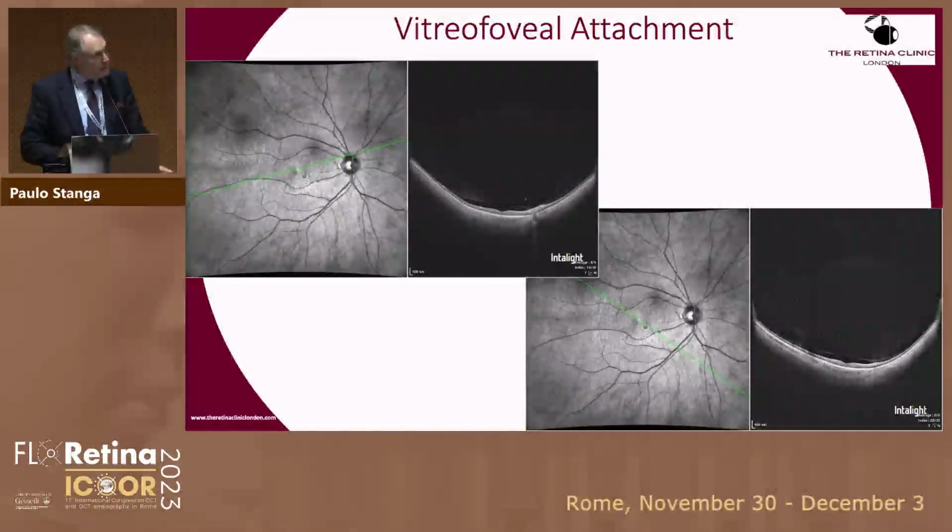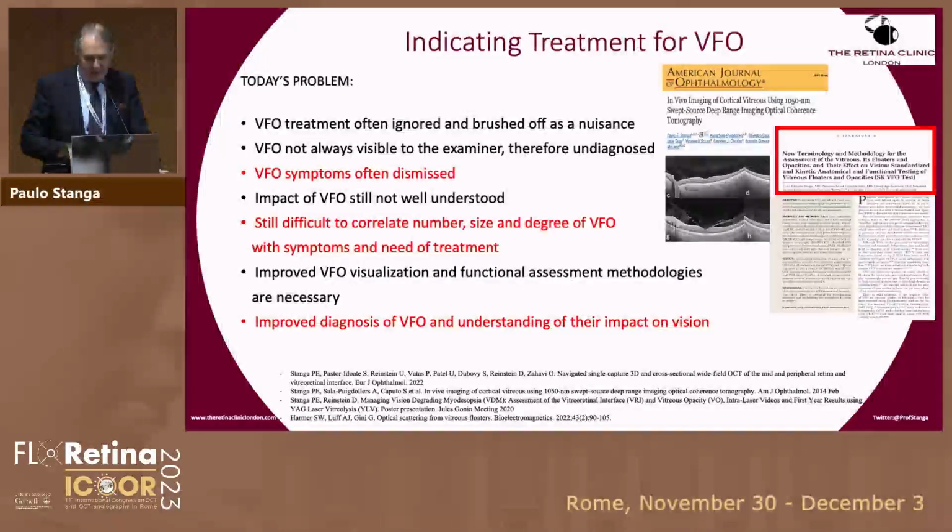This is a patient with a vitreofoveal attachment. If I scan just the macular area, I don't know how much detachment there is in the perifoveal area. With a long scan, I know how much I need to detach, or whether I need to detach intraoperatively or not.